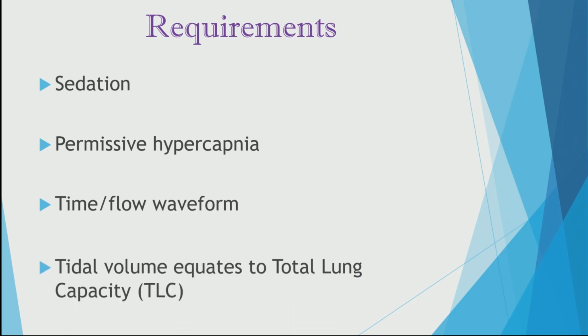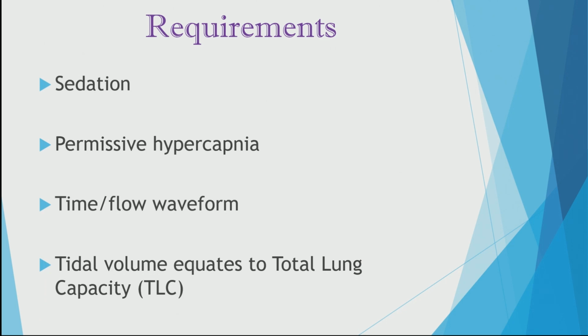Another thing, don't be concerned with big tidal volumes. In fact, I tell people not to even look at the tidal volume, because what's going to happen is that as you recruit more alveoli, the tidal volume is going to equal total lung capacity here, because you're recruiting not just the part of the lung that deals with the tidal volume. You are recruiting the entire lung. So as the lung gets better, as you recruit more alveoli, guess what? Your tidal volumes may continuously go up over time. That is a good thing. That is what you want to do.